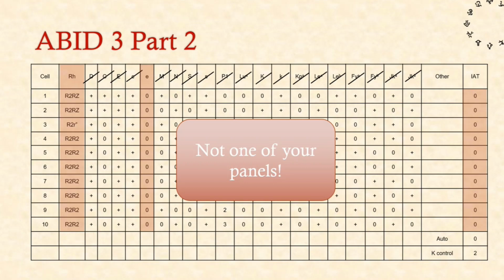Sorry, I froze there. So in case you missed that bit, this is a K control that we use just to show that the test has actually worked. Remember to put your plasma in. So these are all negative. And what you might notice about this panel is that they're all little e negative cells, so it's called an R2 panel.